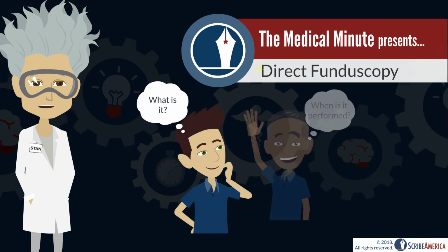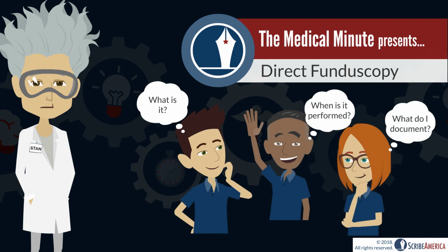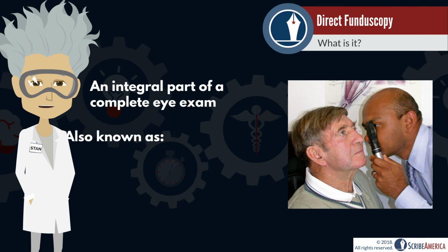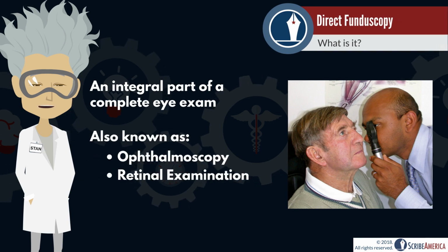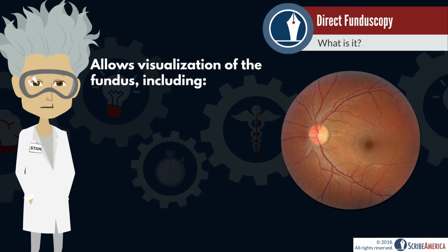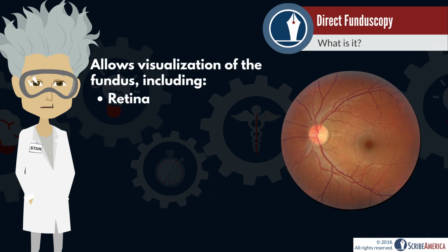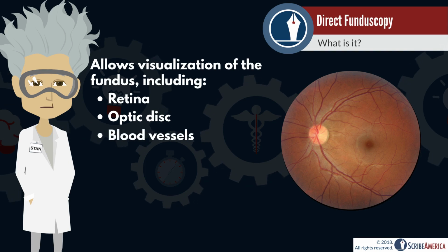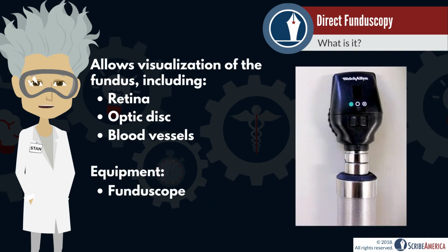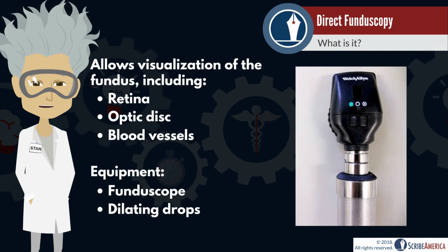This week's Procedure Medical Minute is reviewing direct funduscopy. Direct funduscopy is performed during a complete eye exam, and it may also be called ophthalmoscopy or retinal examination. It allows the clinician to visualize the fundus, which includes structures such as the retina, optic disc, and surrounding blood vessels. A funduscope is required for direct funduscopy, and medicated eye drops may be used to dilate the pupils.